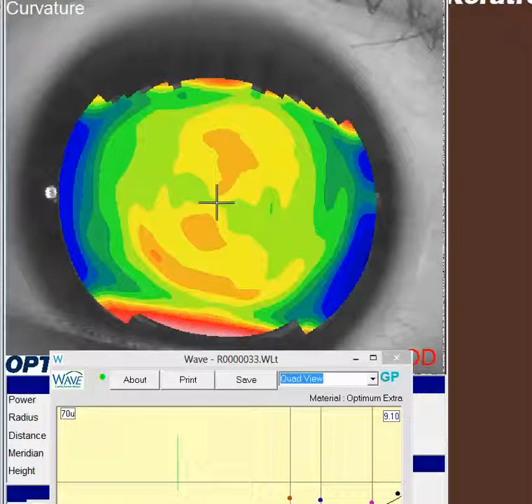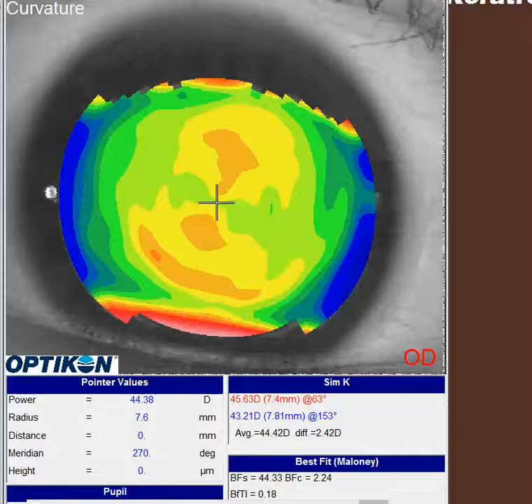I see from your clinical request you're looking for assistance in trying to get your lenses to fit a little bit better. Well, if you look at the designs, first thing to notice with this patient, you have a couple diopters of corneal cylinder. So as you know, your two principal meridians are right about here and this way.